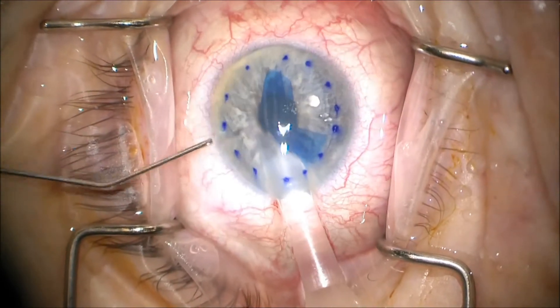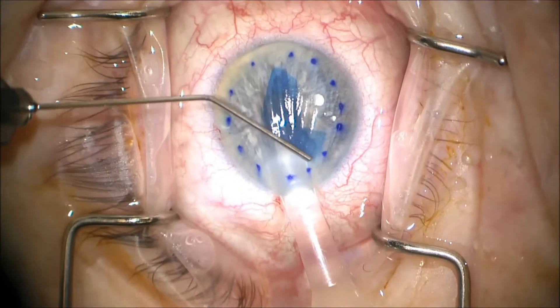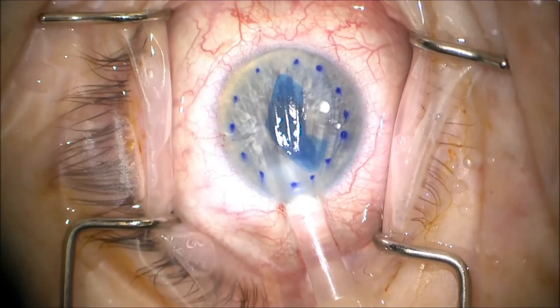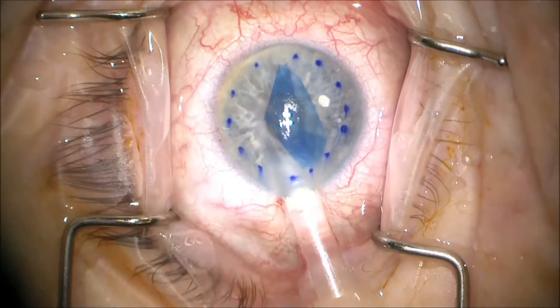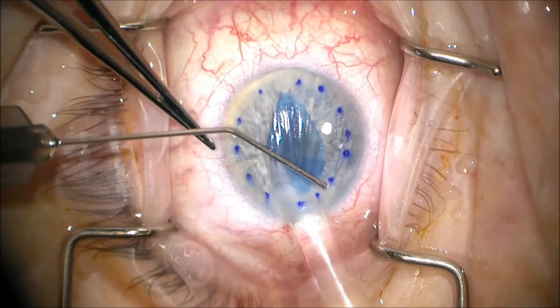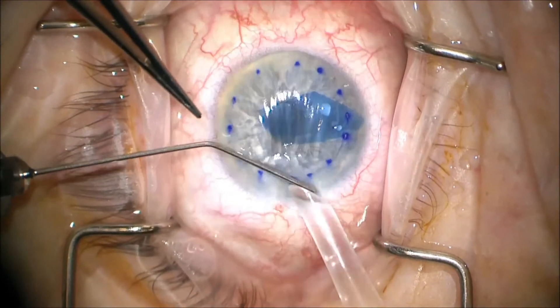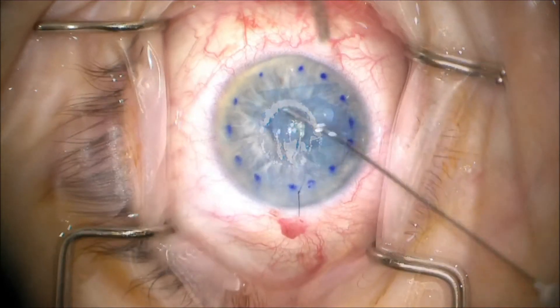Once it's in, we shallow the chamber more to decrease the pressure inside the eye. This helps prevent the graft from extruding out of the main wound. Despite that, we notice it still has this tendency to want to come out, so we use a little more puffs of BSS and use the second instrument to help prevent that.